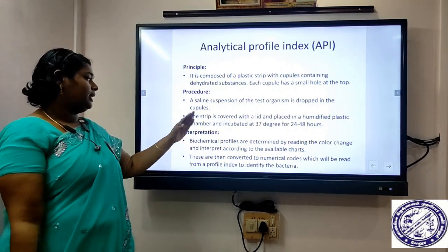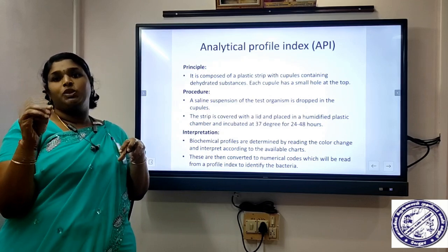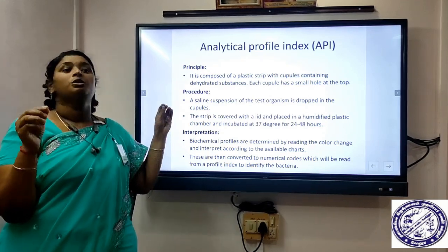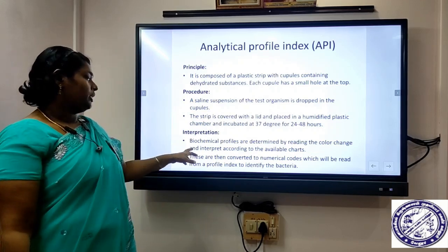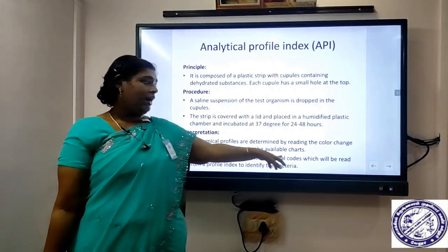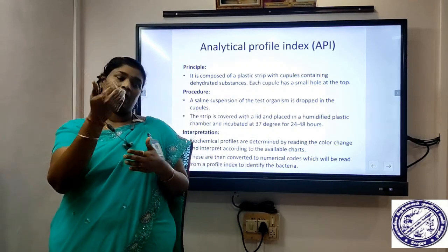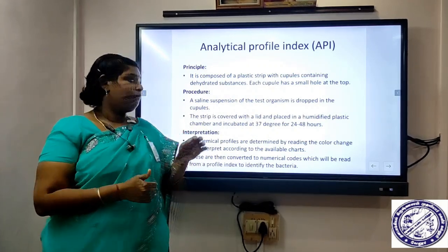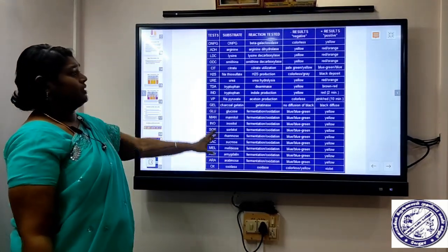After that, the biochemical which has been utilized by the organism in the test suspension we added in the cupules will be converted into a positive or negative reaction. That will be observed with the available standard charts. Each and every analytical profile index has a standard chart. See, this is a standard chart.